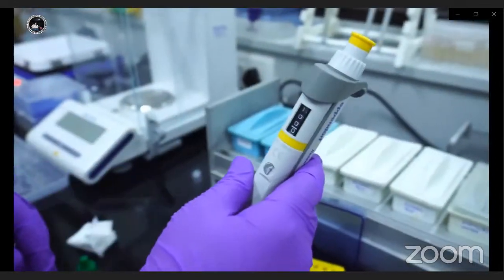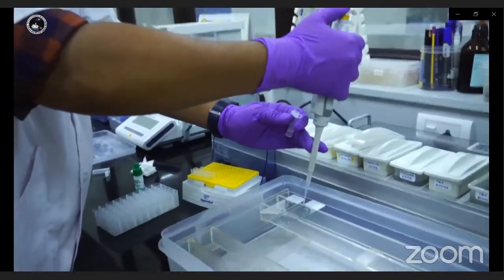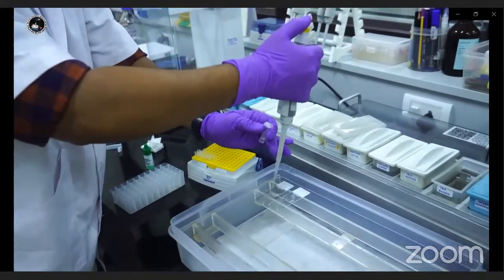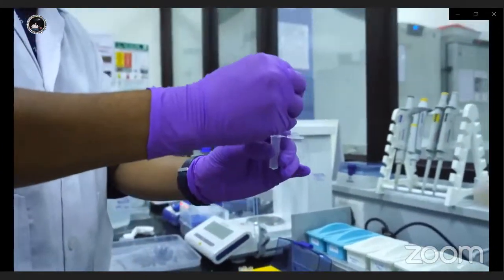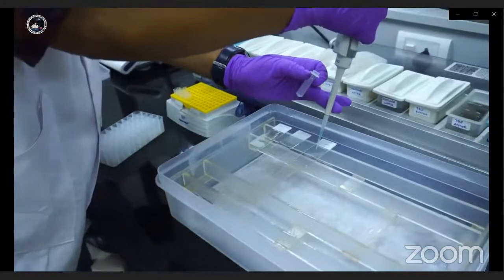Humid chamber plays a very important role in preventing drying artifacts. A thin layer of moist cotton is placed in the chamber. Drying artifacts give false positive and background staining. Apply primary antibody on the sections and incubation period is 1 hour. For ready-to-use antibodies, the antibodies can be directly put on the sections.